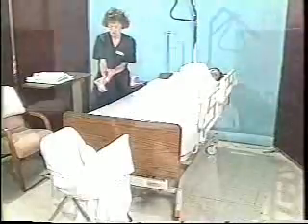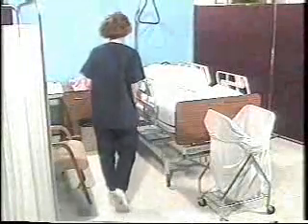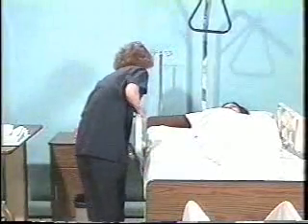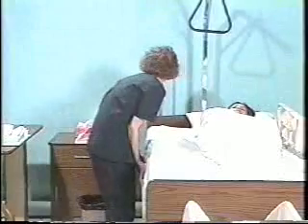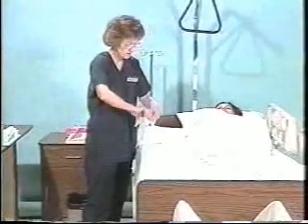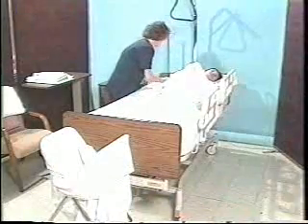She removes her soiled gloves and washes her hands after raising the side rail. Next, she lowers the side rail and applies clean gloves. The mattress pad is going to be reused since it is not soiled, so she makes sure it is smooth and positioned evenly on the bed.